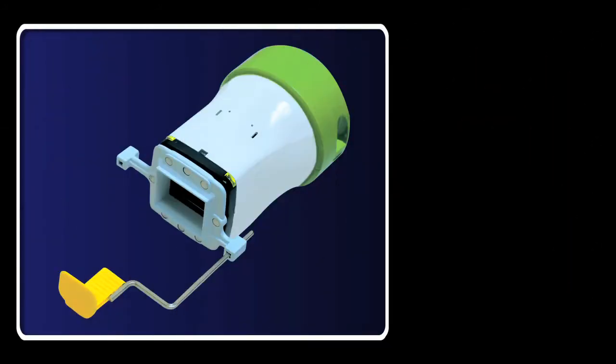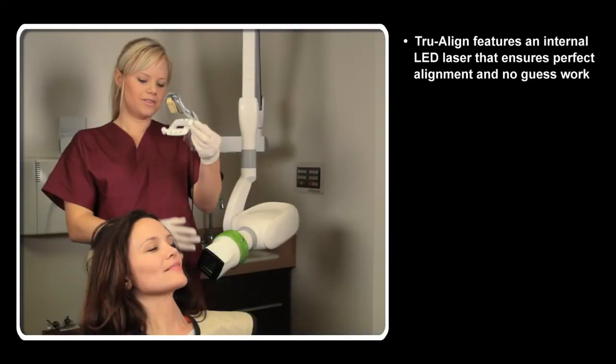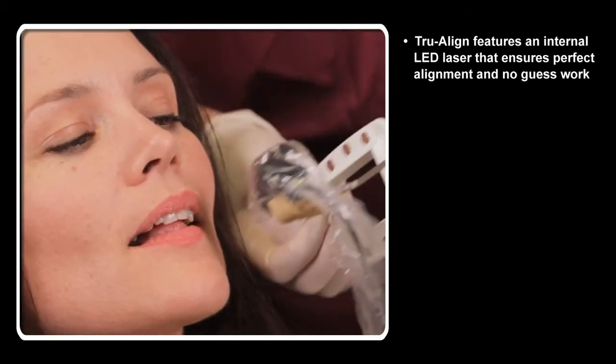TruAlign features an internal LED laser that ensures perfect alignment and no guesswork, eliminating cone cuts and retakes.